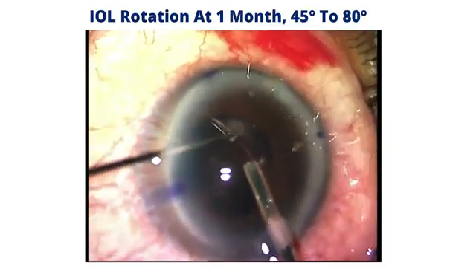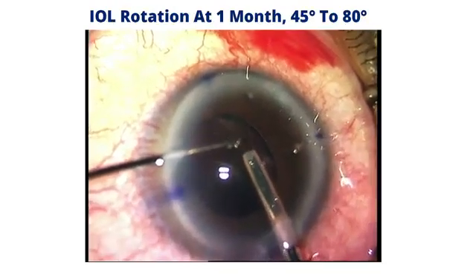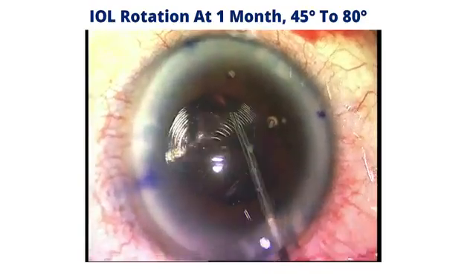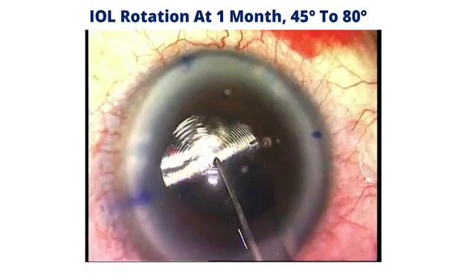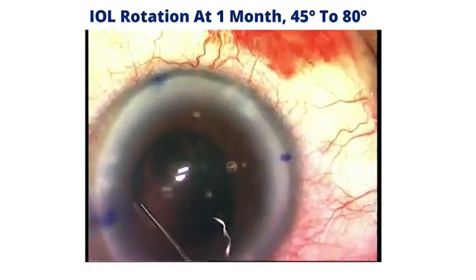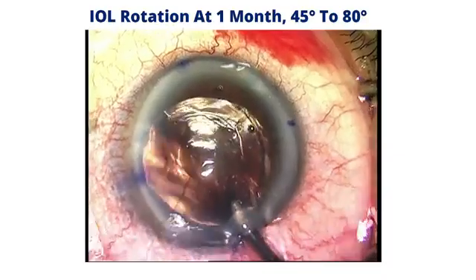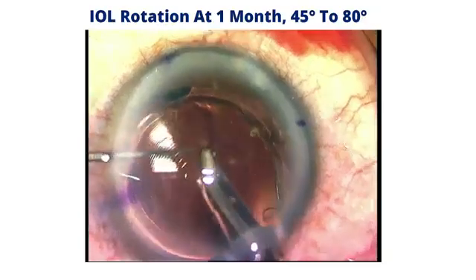And now I'm injecting a plain capsular tension ring into the capsular bag. It's important to have the bag really distended so that this slips nicely into the capsular bag fornices, and then you can see now that the lens is able to nicely and easily center, and now it's just a matter of rotating that lens into the appropriate position from 45 degrees to 80 degrees, and you can see my marking at 90 degrees. I'm going under the intraocular lens to remove all the viscoelastic.